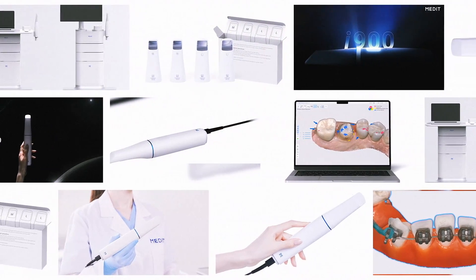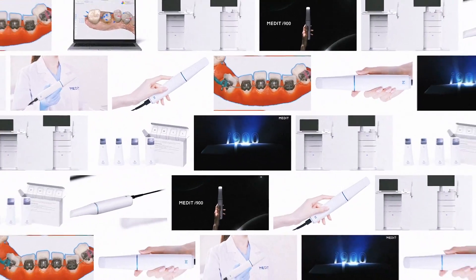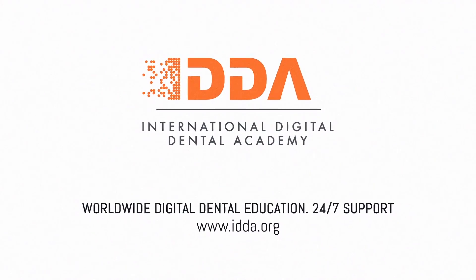Hi everybody, today we're going to give a brief introduction to the Medit i-900, which has just been released. It's a beautiful piece of kit — really like the small compact size. With the new scanner, there's a similar size head to what we had before, plus a really large scan head as well. It's a very clean design.